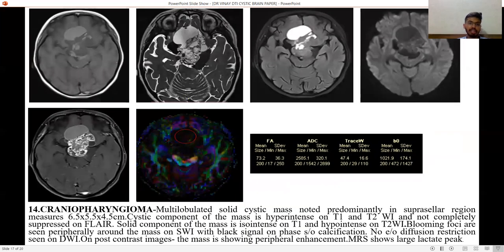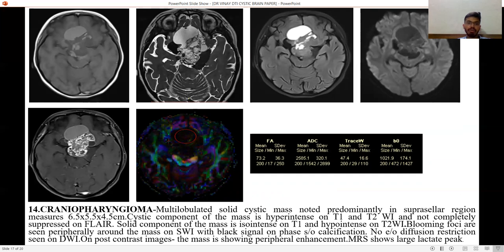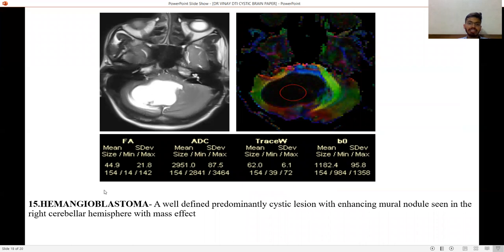Craniopharyngioma — a multi-lobulated solid-cystic mass noted predominantly in the suprasellar region. The cystic component is hyperintense on T1 and T2 and not completely suppressed on FLAIR. The solid component is isointense on T1 and hypointense on T2. Blooming foci are seen peripherally on SWI suggestive of calcification. No evidence of diffusion restriction is seen, and on post-contrast the mass shows peripheral enhancement.